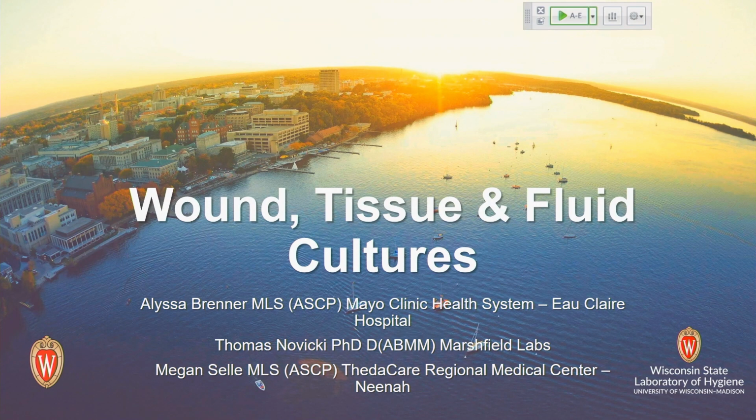It makes sense. Has this been published, or did you do that de novo? There's a lot in the literature about using blood culture bottles to do these prosthetic joint infections. So it's work up front, but then going onward you're saving because you're not working up all those plates. Correct. And they're getting maybe charged less because it's not 5 or 6, it's 3 or 4, if I understood you correctly.